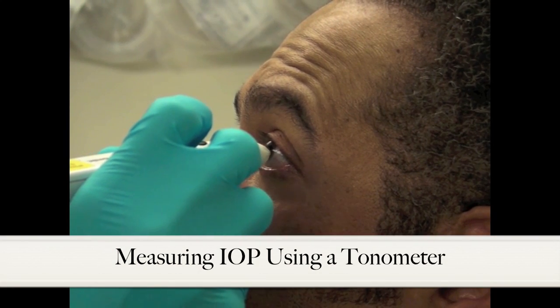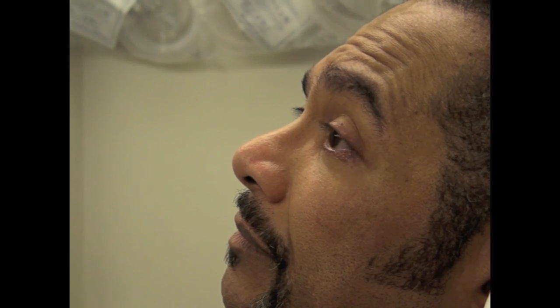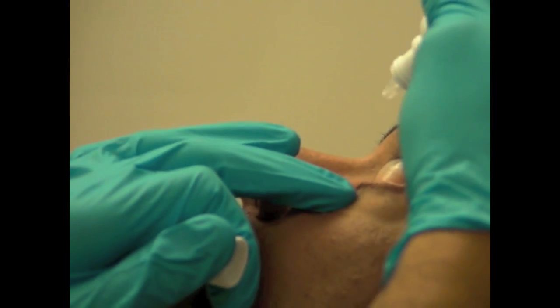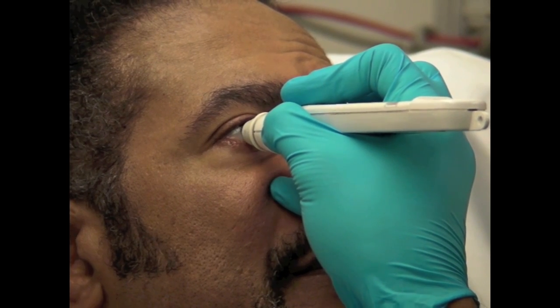An important aspect of the eye exam in emergency situations is evaluating a patient's intraocular pressure through tonometry. This chapter will focus on the correct method of calibrating a portable electronic tonometer, applying anesthetic drops to the patient's eye, and the motion required to correctly use the portable tonometer.